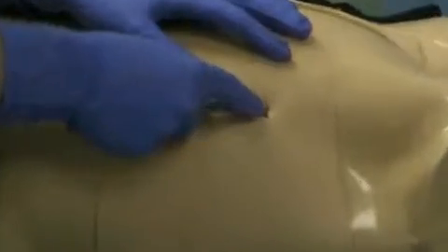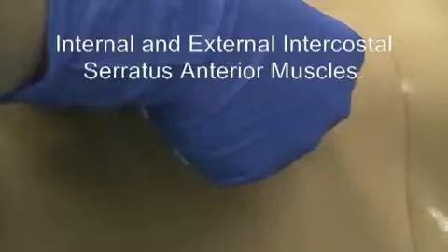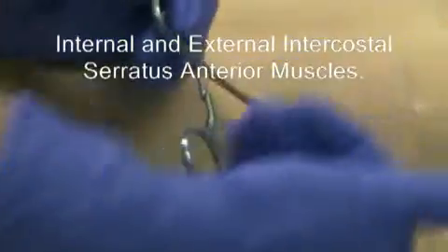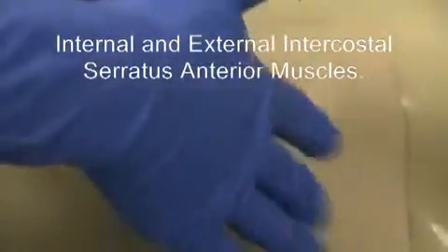So in, feel the rib, go up and over, and it does take some force to push through the chest wall. There's a lot of musculature there, and they're very strong muscles obviously because they help us breathe. And once you feel yourself pop through, oftentimes you'll get a rush of air or fluid depending upon what your patient's particular disease process is.